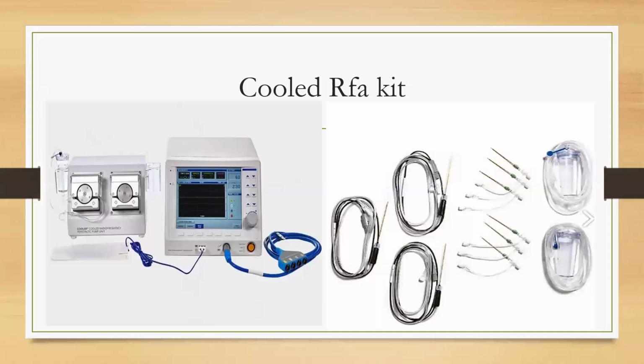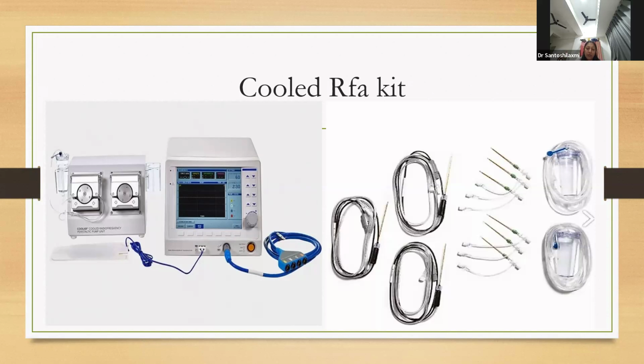Sir, no. And sir, in this, temperature generation can be controlled in cooled RFA. Yes, we will come to that. Good. Fantastic.